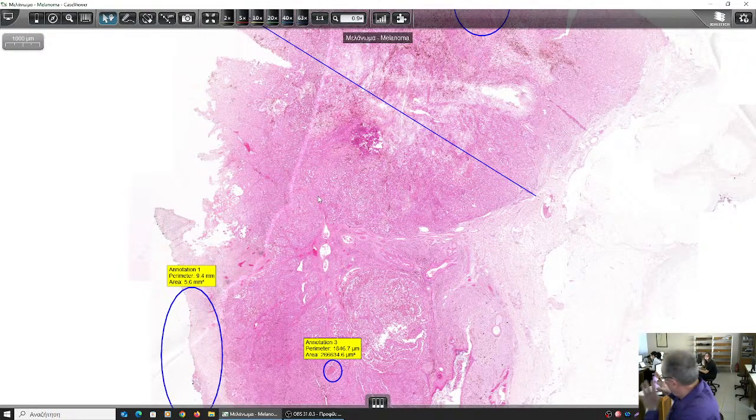If you are not sure that these are melanocytes because you saw coarsely granular melanin, and you are not sure that the melanin is in the malignant cells, you perform immunohistochemistry and define these cells as melanocytes. It has other features of malignancy, so this is a malignant tumor deriving from melanocytes, so this is a melanoma, and which is the most important prognosticator?